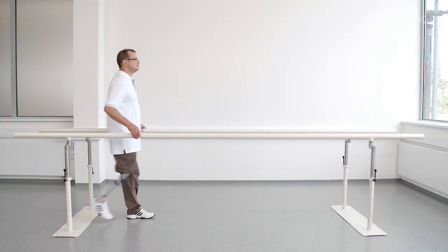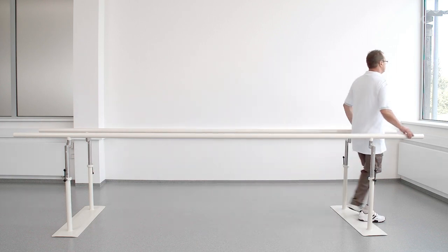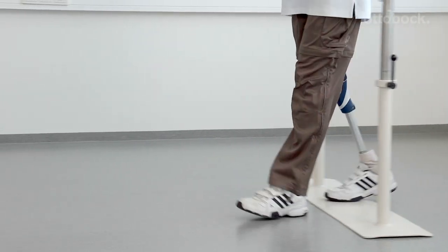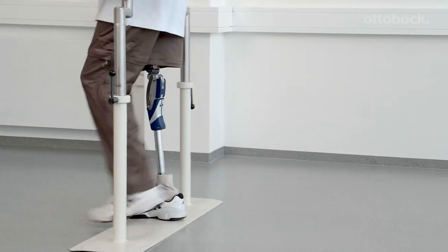To get a first impression of the knee joint's swing phase control, have the patient walk in the parallel bars with the factory settings. The following video sequence will demonstrate how the knee joint reacts to the extreme settings of the swing phase damping.